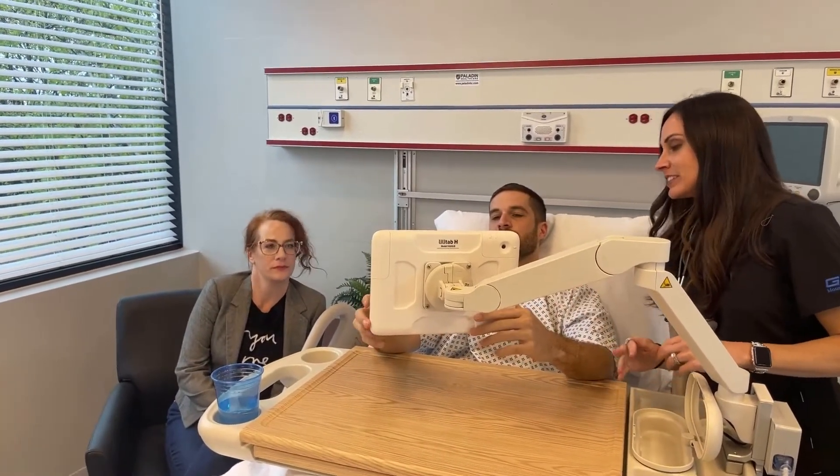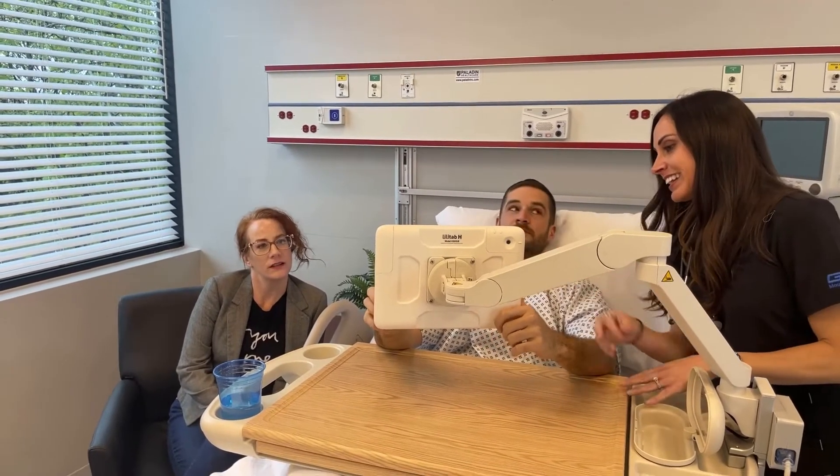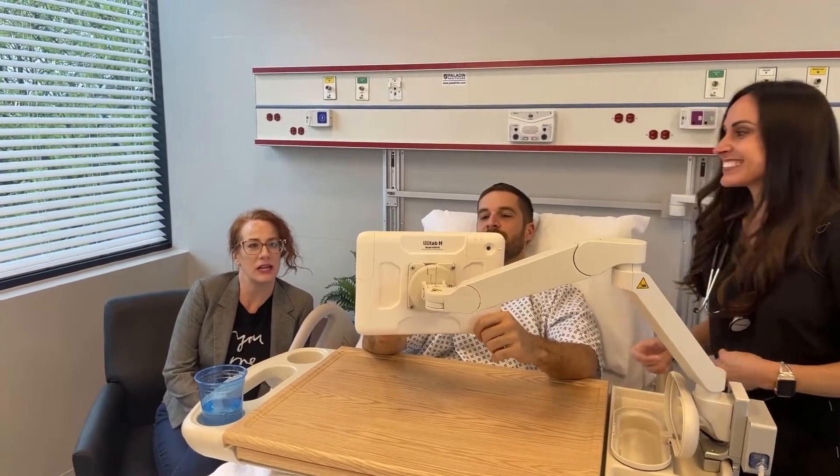Transform your patient's experience by allowing them to connect with loved ones, providers, and their medical records.